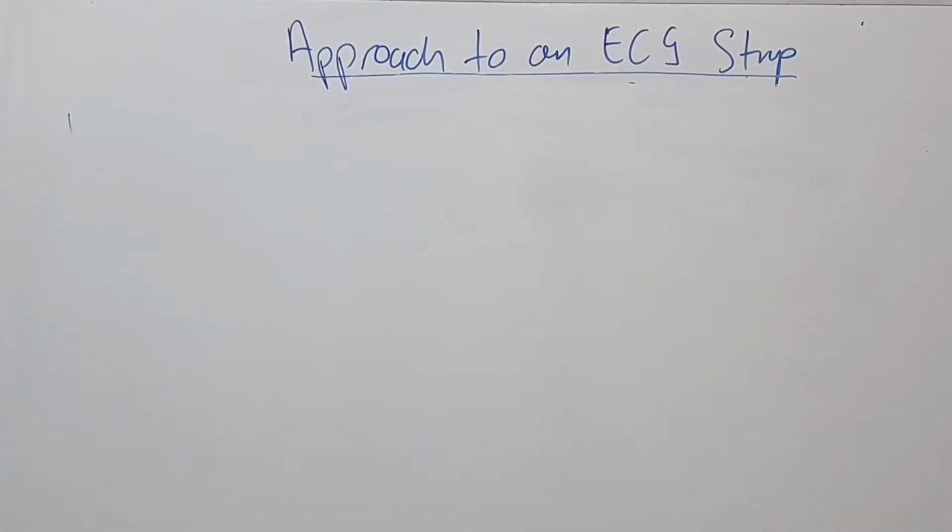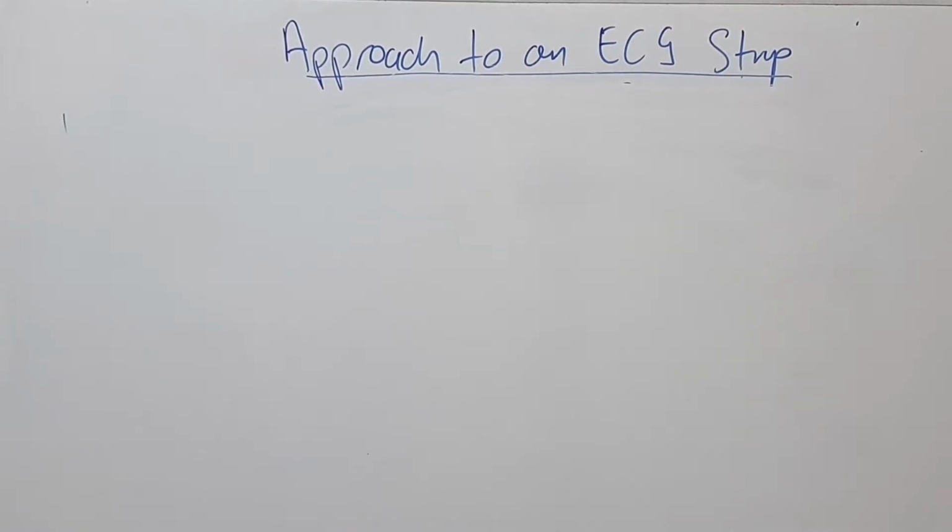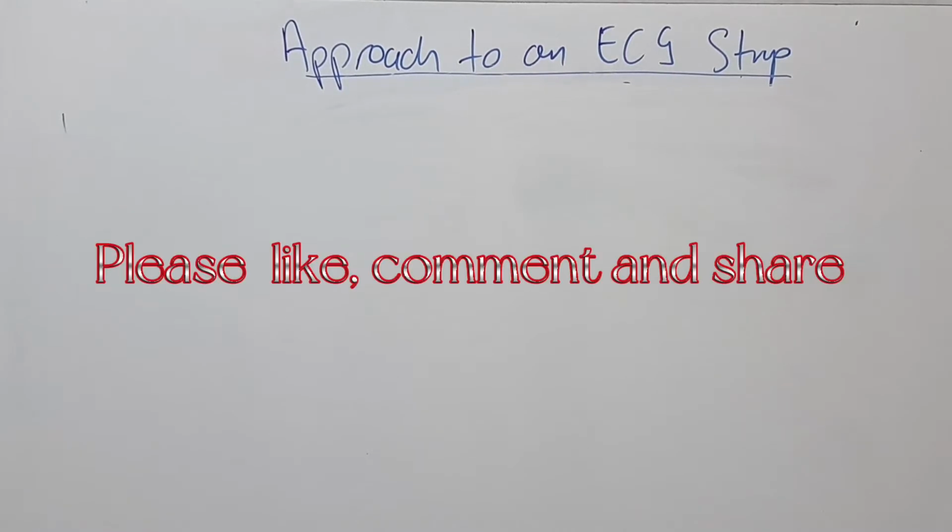So guys, in this video, we are continuing with our ECG series. People have been asking me to cover ECG basics since last year, so finally I've decided to actually do it, and it's going to be a long series. It's a very big animal, but we're going to chew it in small pieces, and I hope by the end of the series everyone will be confident and will not shy away and run away from doing ECGs and interpreting ECGs.